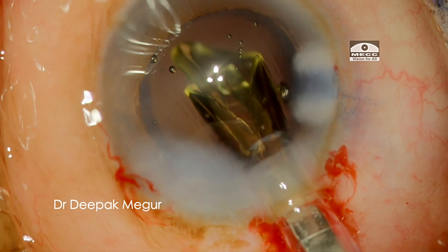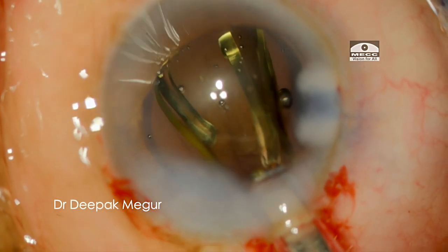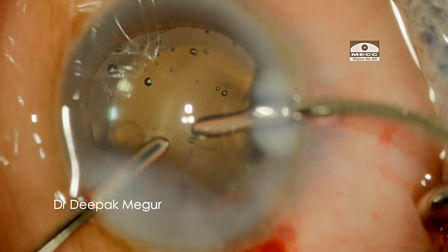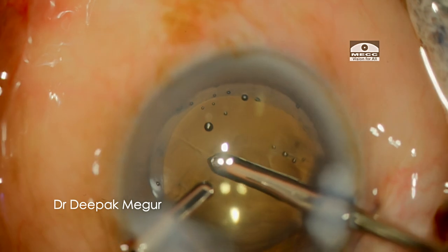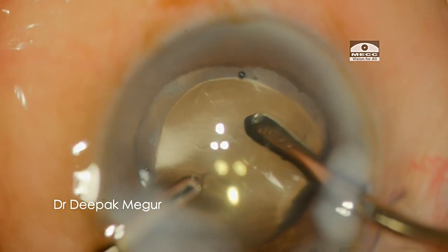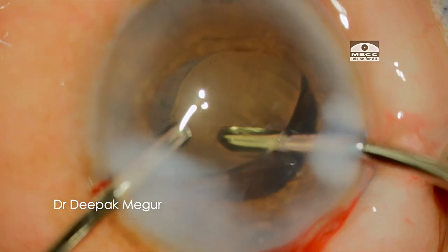Now it is time to place the IOL into the bag. Care is taken that the haptics are oriented 90 degrees away from the anterior capsular tear. Finally, the OVD both in front of and behind the lens is removed.